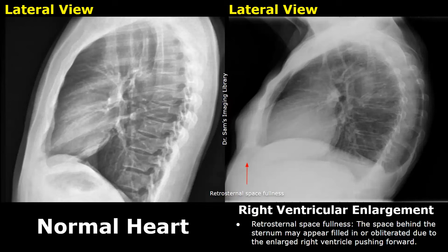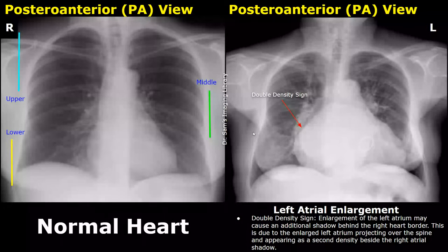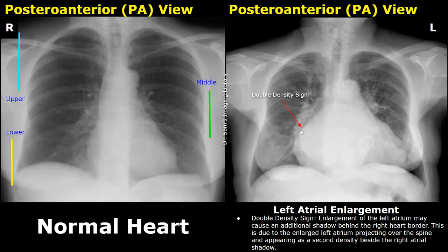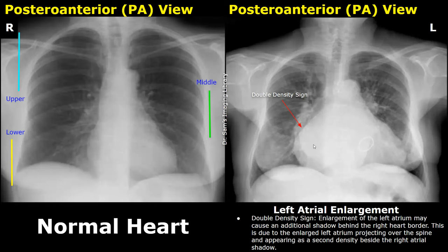Now we have a case of left atrial enlargement. One of its features on X-ray is the double density sign. Due to the enlargement of the left atrium, an additional shadow is found behind the right heart border. This is due to the enlarged left atrium projecting over the spine and appearing as a second density beside the right atrial shadow — this is the double density sign.